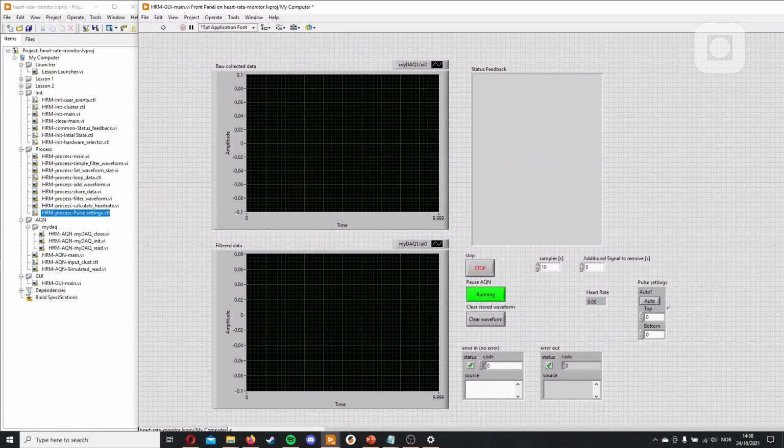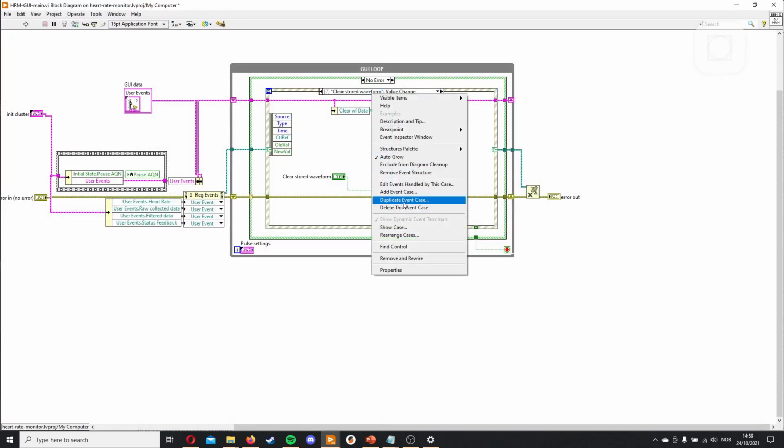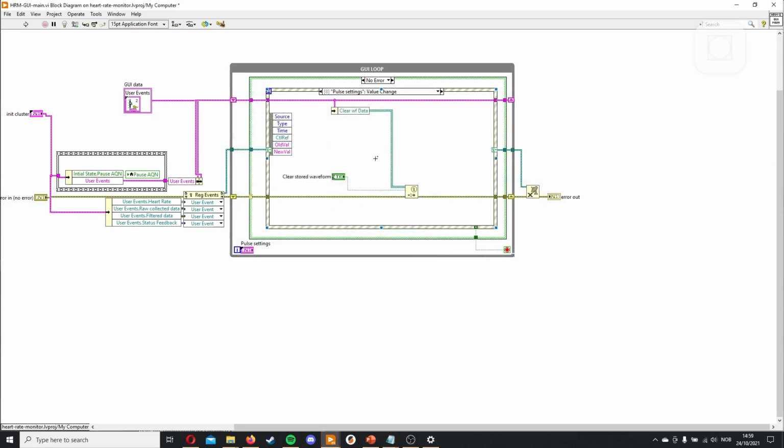We can use them as it is now or separately. For now I'll just use it as it is, as it's simpler, and maybe we'll add some changes later, then this will be updated here. But you could easily just drag them out and push them manually into the function. And then let's duplicate this waveform to pulse settings, all elements, so if any of the elements change it will update.